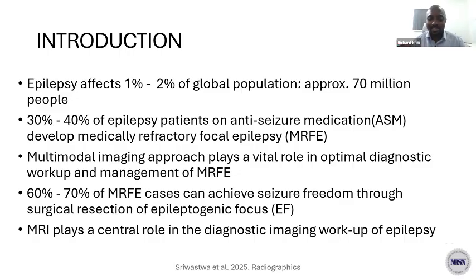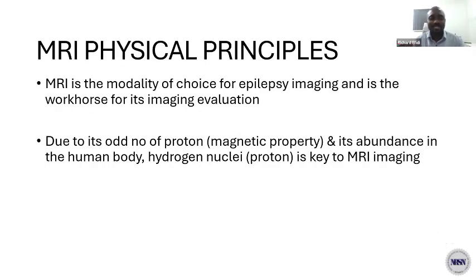Multimodality imaging approach actually plays a role in optimal diagnostic workup and management of drug-resistant epilepsy. And more than half of these cases go ahead to achieve seizure freedom after surgical resection of the epileptic focus. MRI plays a central role in the imaging workup of epilepsy, being the workhorse modality. So we'll briefly look at the physical principle.